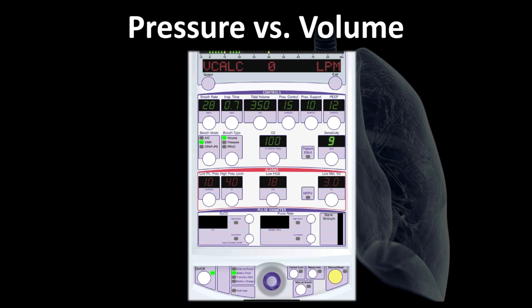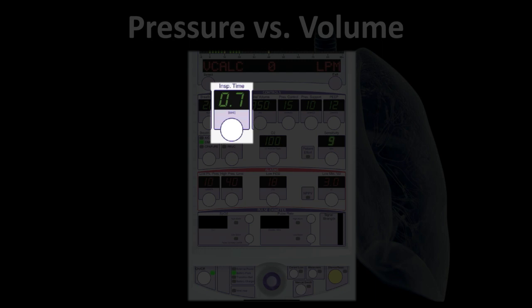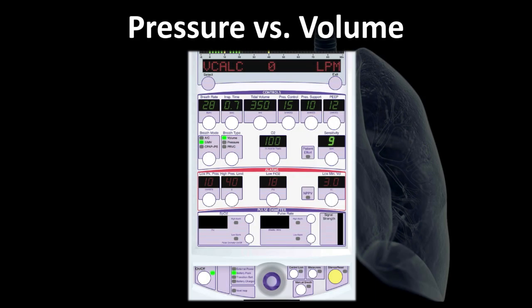Why is that? Because you've got to remember, as our patients become more constricted, their airway caliber becomes smaller and smaller. In the standard method of delivering a breath, we have to understand we're delivering an inspiratory time and an expiratory time. Based on that standard setup, if we set an inspiratory time of, let's say, as we see on the screen, three-quarters of a second, so 0.7, the rest of that is basically your E time.